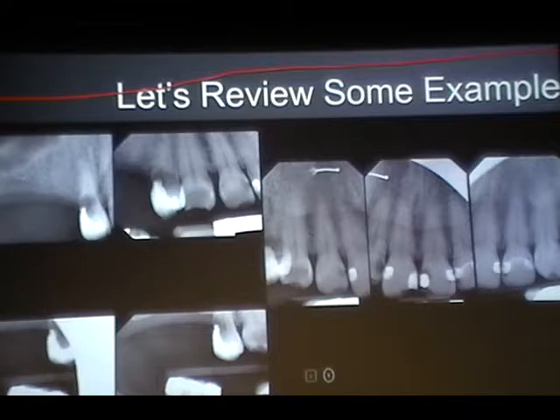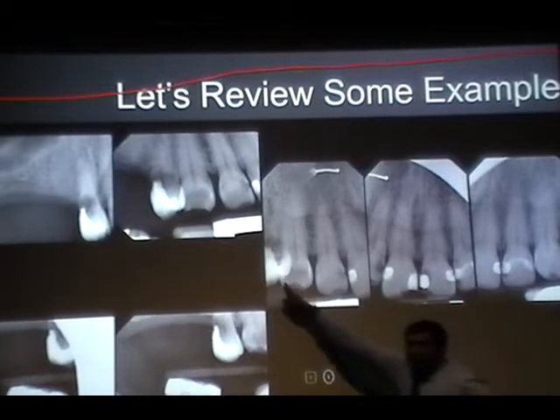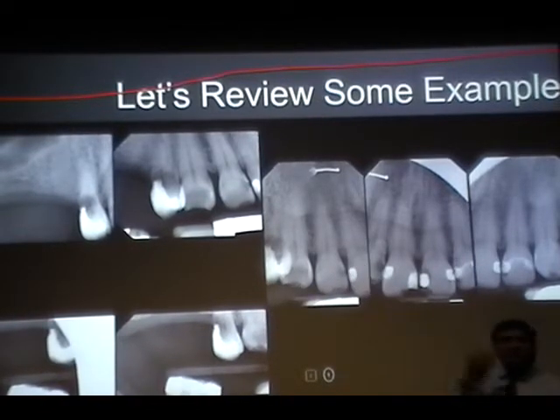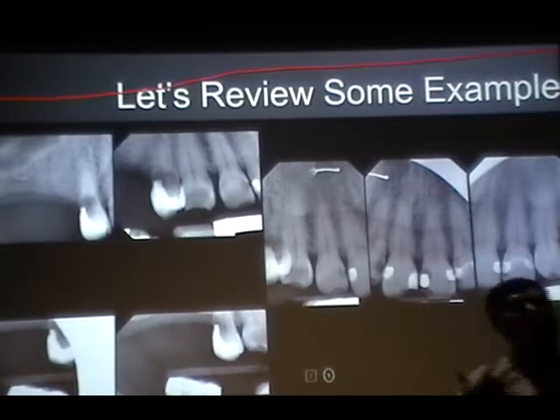How many disagree? So remember, in this view, you want to see the contact open only between this and this, not this and this, because that's why you want to capture the distal of the canine in this particular view, because there is a curvature. You can never open a contact in that particular view, unless there is a diastema or something. Okay.